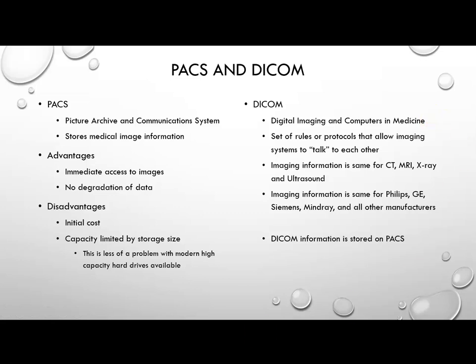DICOM, on the other hand, is not the picture storage, but it is the protocol or the language that systems talk to each other. Okay, so DICOM is the language of the imaging department's computers. And CT can talk to an MRI, can talk to an ultrasound, utilizing a DICOM format, okay, or a DICOM protocol.